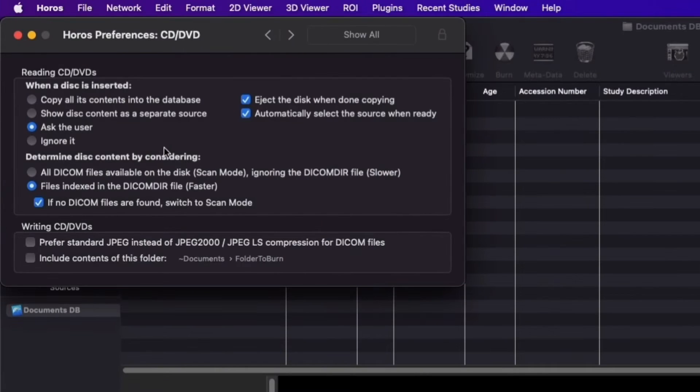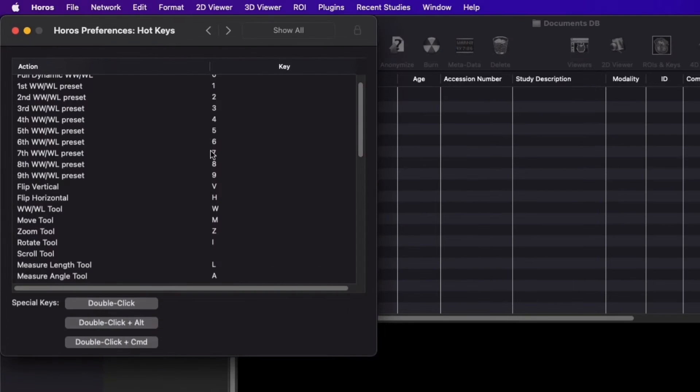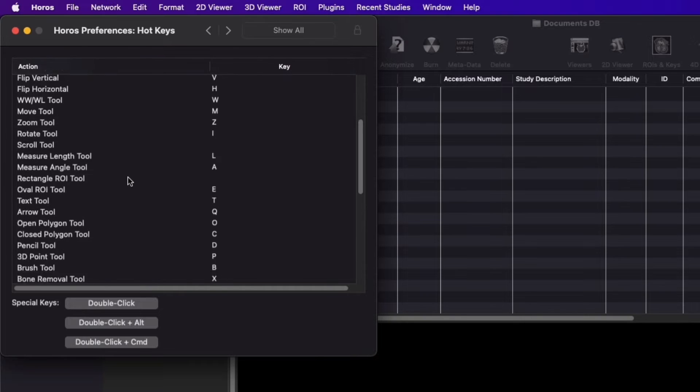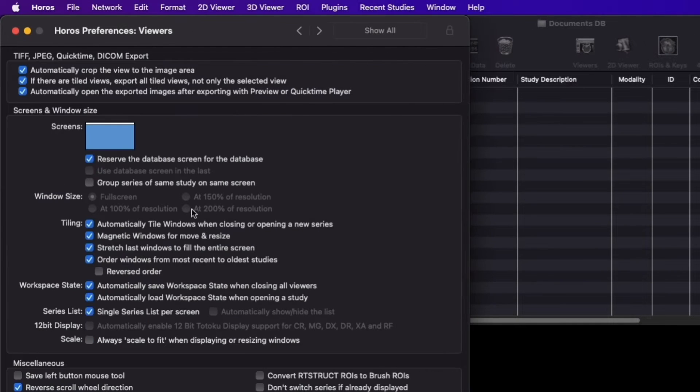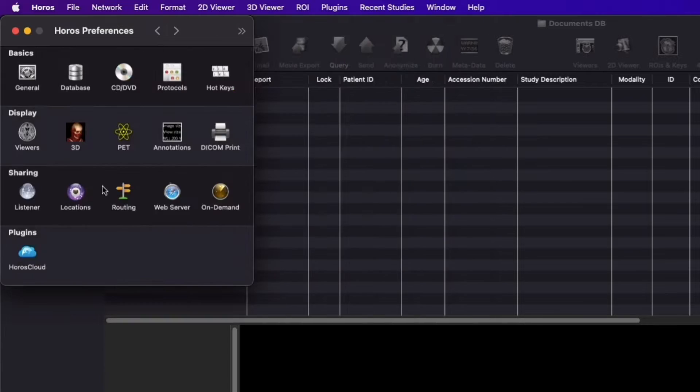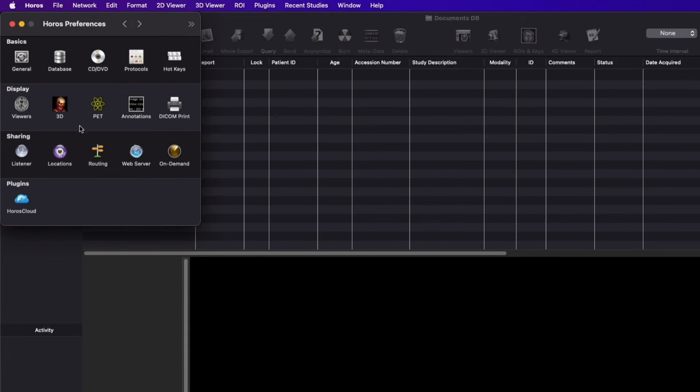With this tool, you can import patient DICOM images from a CD or DVD. You can set shortcut keys to your preference in the Hot Keys section. In the display menu, you can adjust settings for 2D and 3D viewers along with annotations and DICOM print.